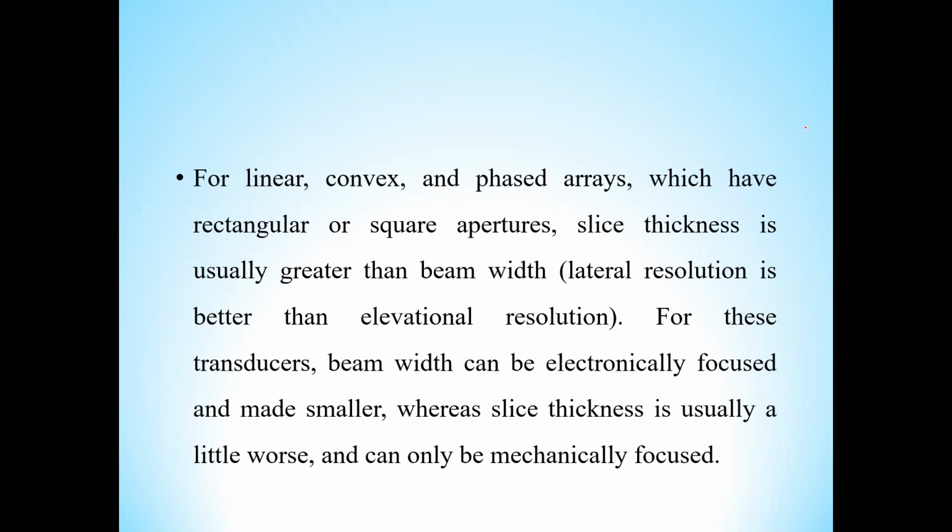So for these transducers, beam width can be electronically focused and made smaller, whereas thickness is usually a little worse and can only be mechanically focused.